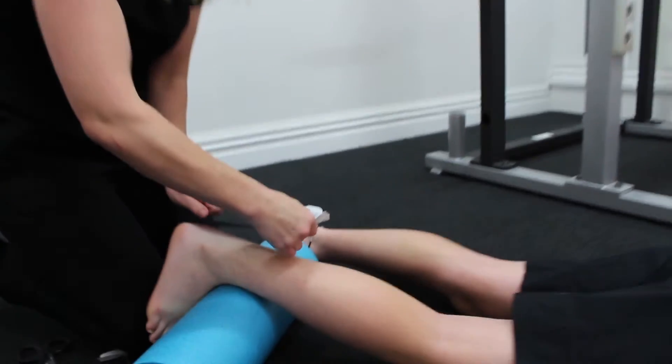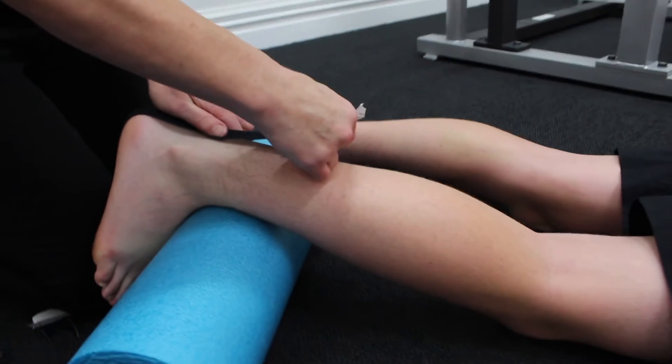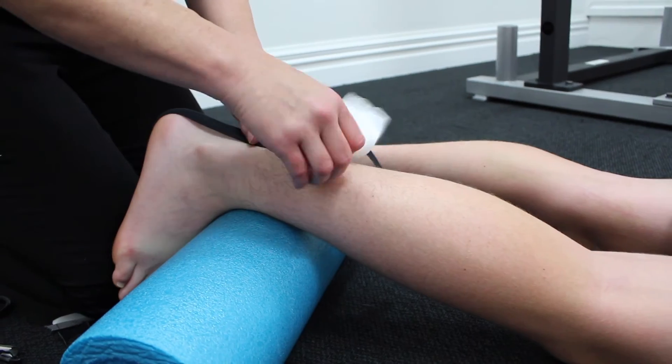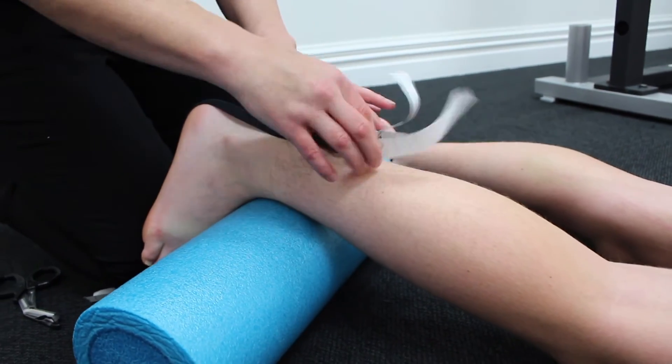I'm going to put tension on the tape and run it straight over his Achilles tendon, then rip the tape right through.